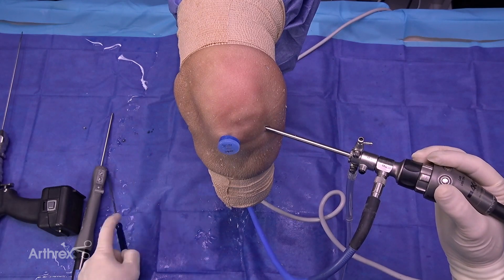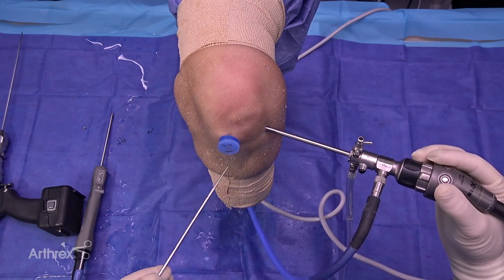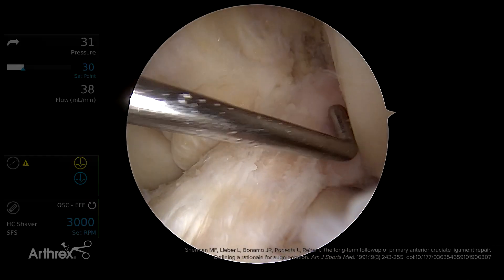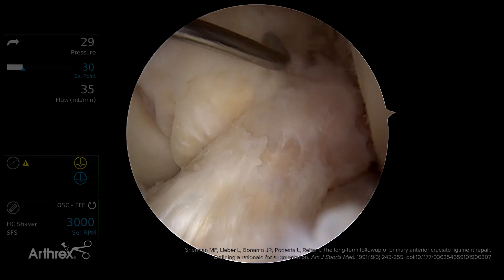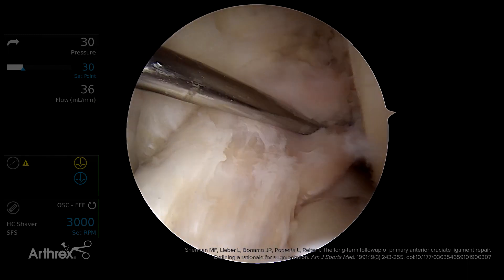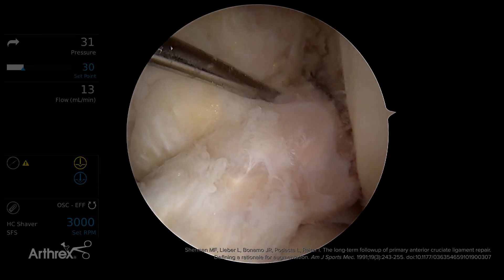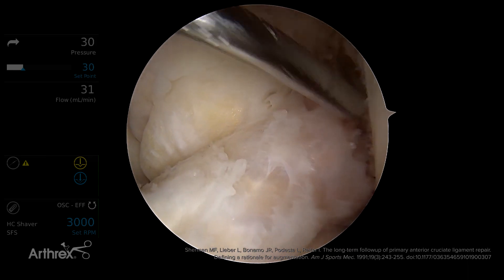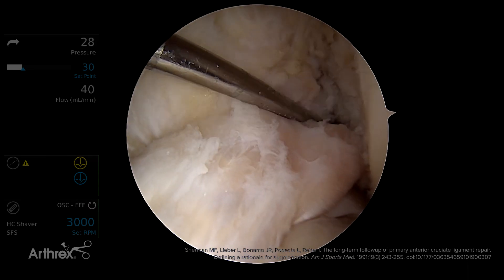Here we have a left knee specimen with an ACL where we've made a proximal tear — the type 1 tear that we've reported on. Within 10% of the femoral wall is what we usually call type 1 tears. If it's within 25%, that's a type 2 tear. Those are the ones we focus on trying to repair.